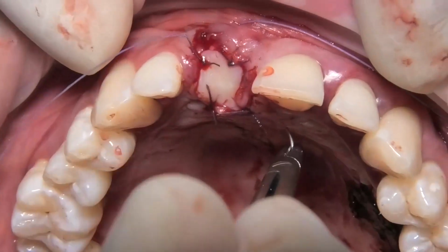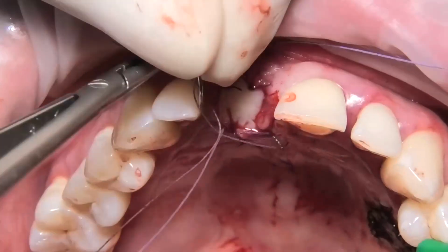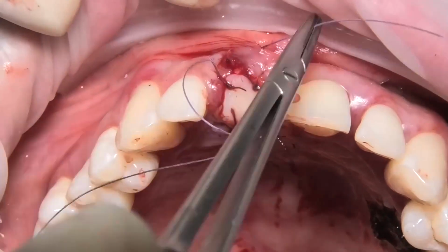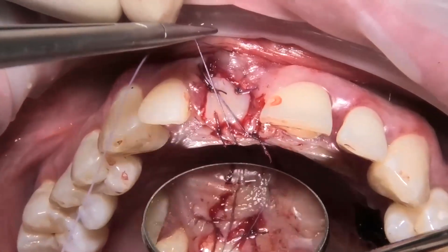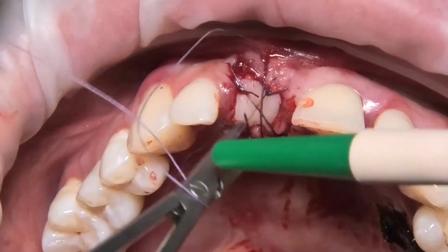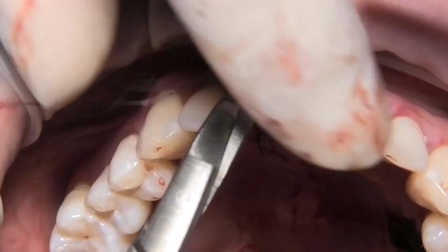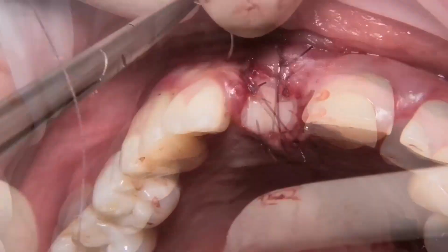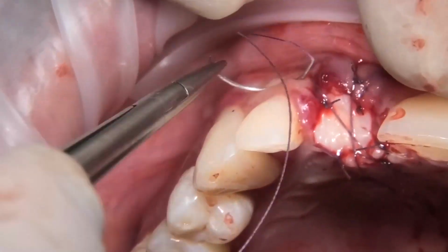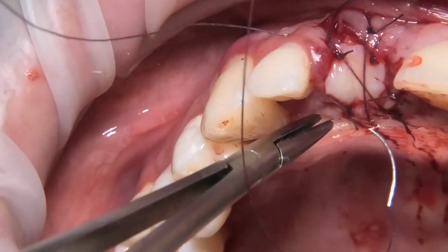We enter on the vestibular, and then after this we go on the palatal, and when we tie the suture, we have the movement. We move the flap against the punch. We can do the first one and the other one on the distal aspect to block the graft.